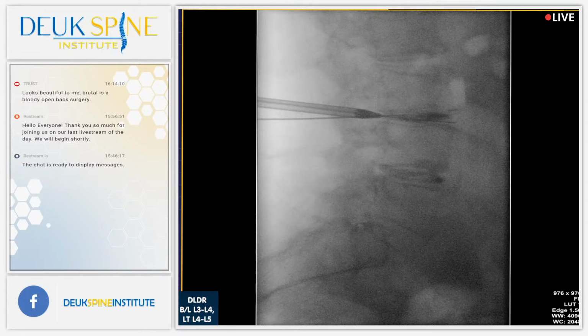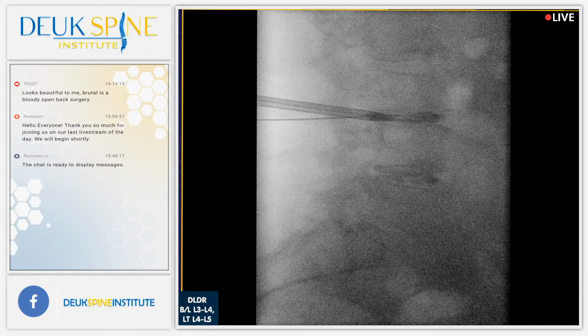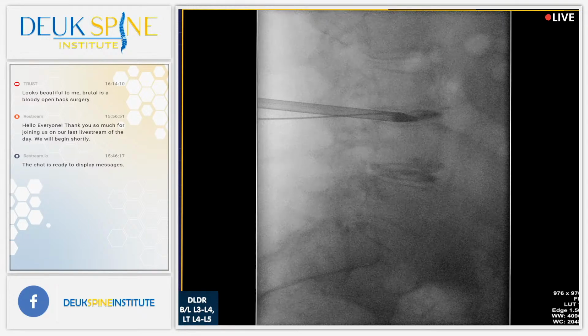What I'm saying is if the part that touches your face is hard, then yes, it needs to mold perfectly. So with a gel coat, why wouldn't it mold to his face properly? Because of the nose when it protrudes out, it doesn't get the seal. You can't get some patients with a different size.